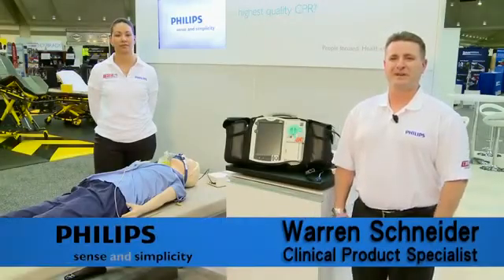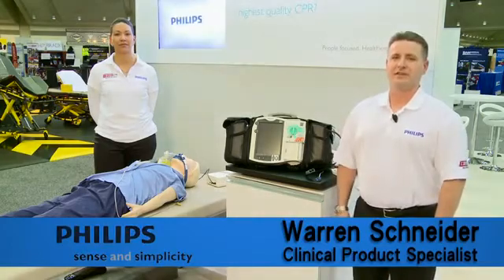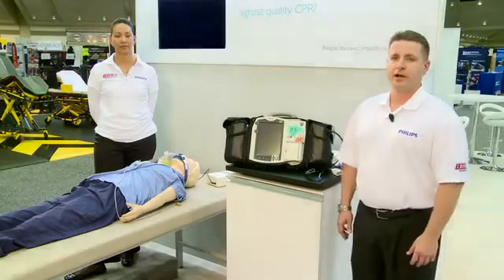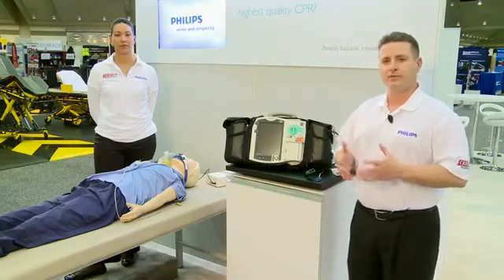Hi, my name is Warren Schneider with Philips Healthcare and this is my colleague Heather McLeod. Today we want to cover some of the features of the MRX Monitor Defibrillator. Some of the key points we're going to bring out are ease of use, speed to shock, and overall ability for the machine to keep up with the practitioner for patient care.